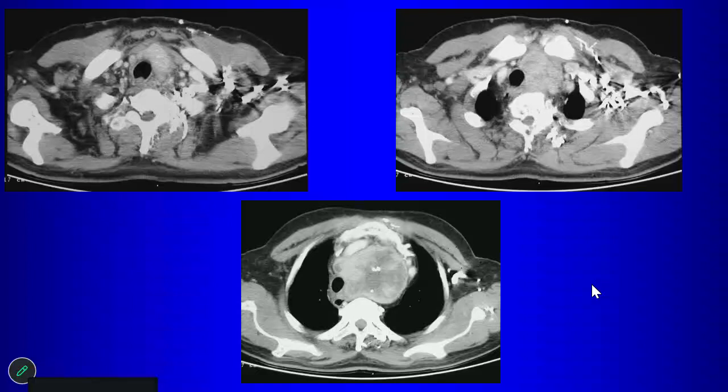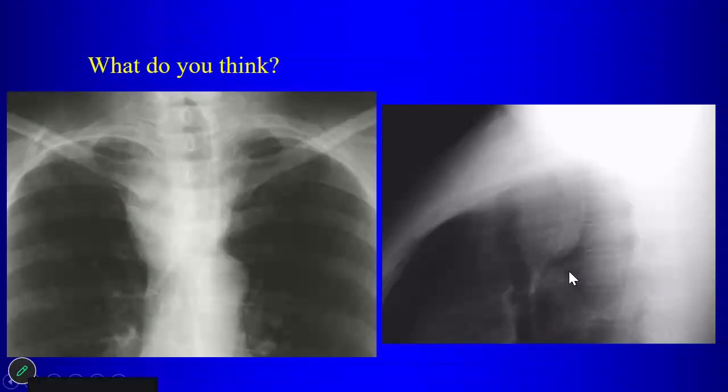But again, you know, that rule is not 100% reliable. You do have to ask the patient, how long have you had this? Has it been growing rapidly recently, et cetera, et cetera. But those are features on the imaging that, at least you don't have any features on the imaging that definitely tell you that that's a malignant mass.